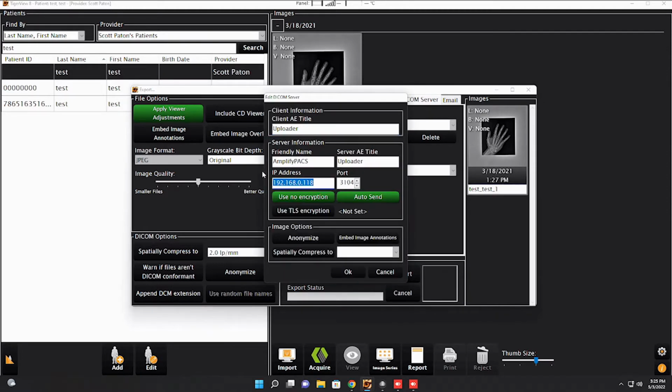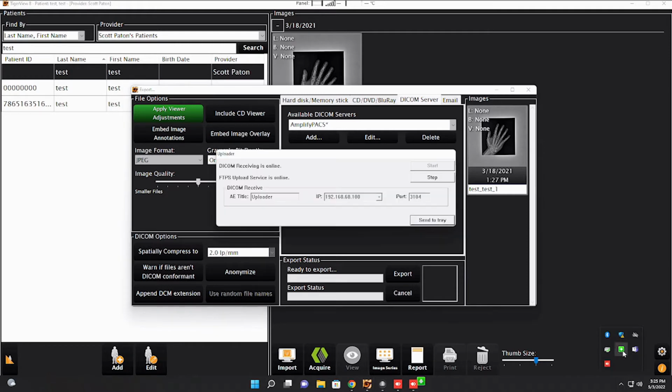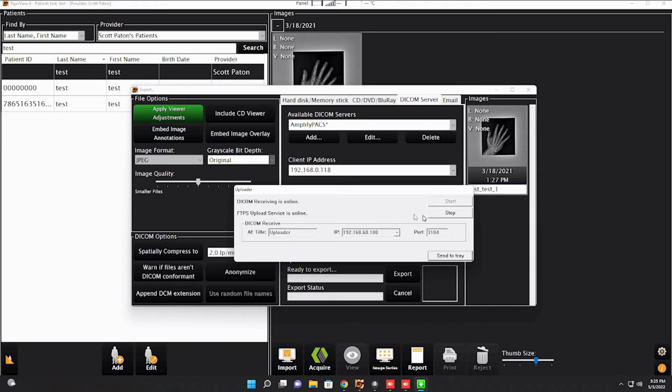Take note of the IP address. Make sure the IP address matches here under Client IP address, and then open the uploader by clicking on the little arrow icon here to see the hidden icons, and click on Uploader. And we'll see that the IP address does not match what is in TigerView, so we're going to change that.